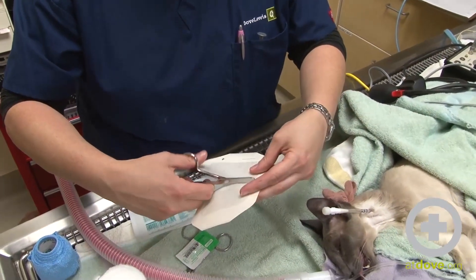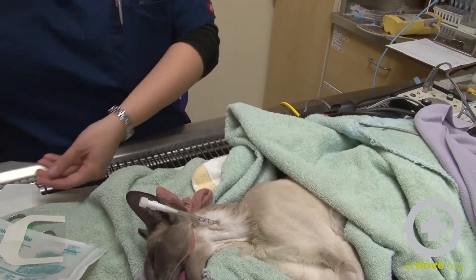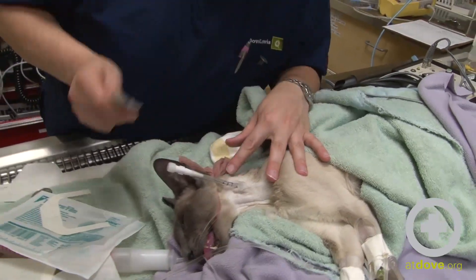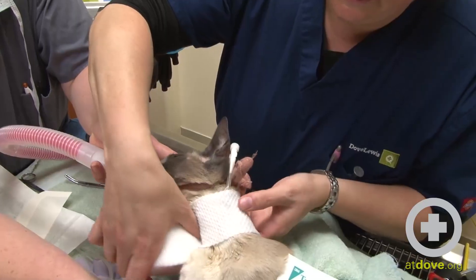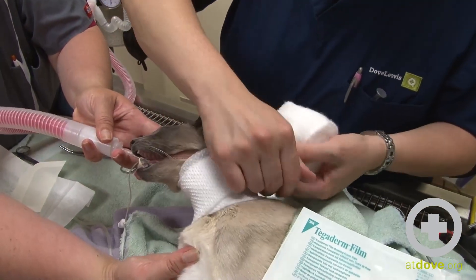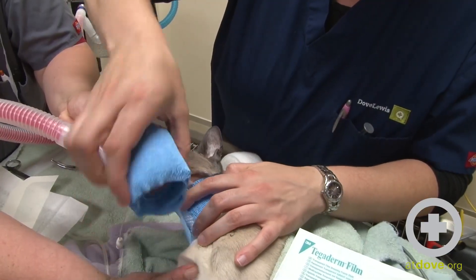We place a clean, dry wrap over the site that gets changed once a day when the animal is in the hospital. We start with Tegaderm so that we can see the incision site and monitor how clean it stays. Before putting the Tegaderm on, we apply a little antibiotic ointment and then the Tegaderm over that. I prefer the Tegaderm over Telfa because you can see the site. We then do a light wrap with cast padding and vet wrap — try not to give them too much of a turtleneck so they can still move their neck. Always backroll your vet wrap so that it's nice and loose when you apply it.